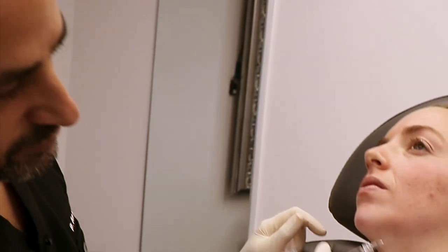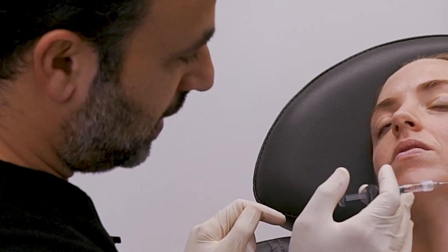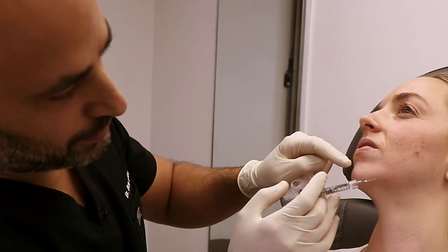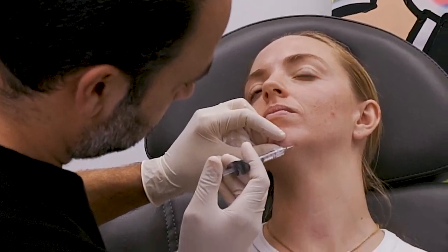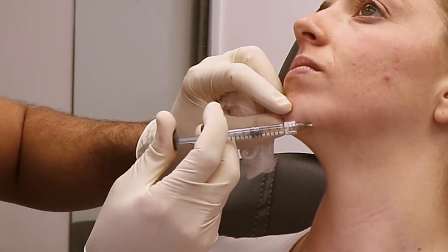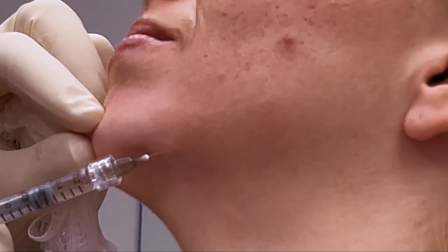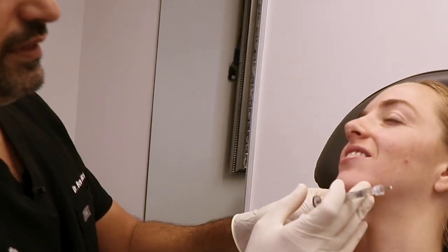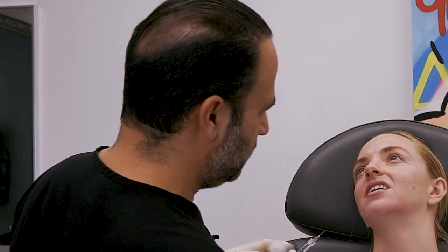When we camouflage it, you have to inject this three-dimensionally — outwards and downwards. We're dropping this to match the level of the jawline and the chin. I like to do this in a subdermal plane. There's a small chance of bruising here, so if you use a cannula you're probably a little better off. We do a tiny little bit there, massage it in, smooth it out — it's almost all the way corrected already.